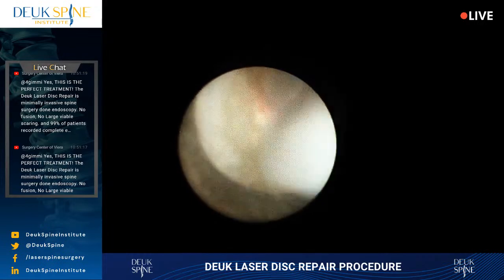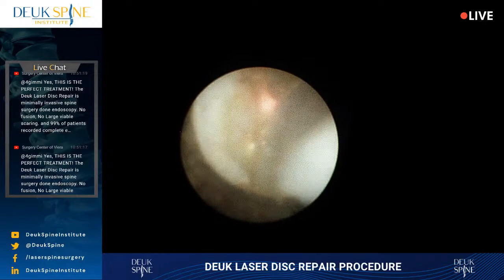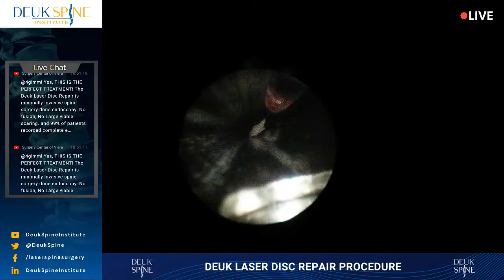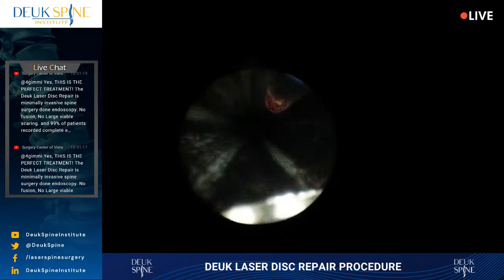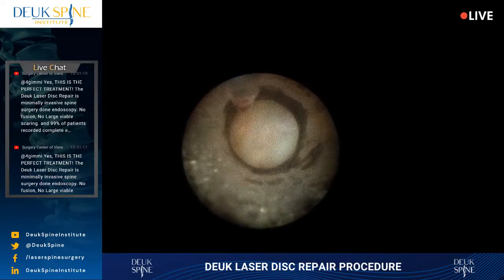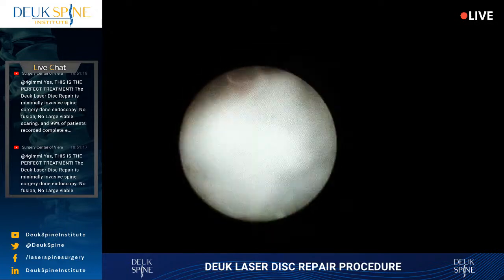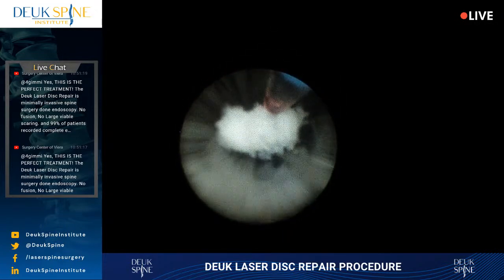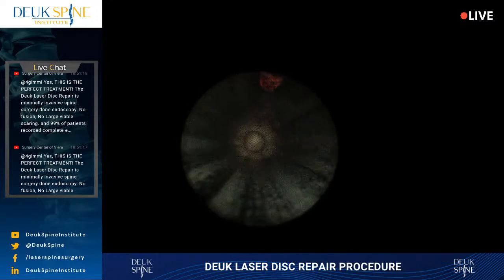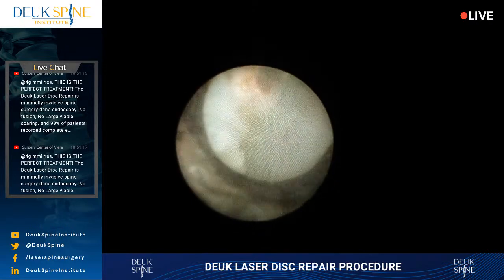I wasn't the first person to do endoscopic anterior cervical transdiscal surgery, but what we figured out here at Deuk Spine was that it wasn't just the herniation that was the problem, it was the tear that the herniation came out of. And by repairing that tear, we could get rid of the patient's neck pain and headaches. So our goal has become not just to fix the arm symptoms, but also to fix the neck pain.